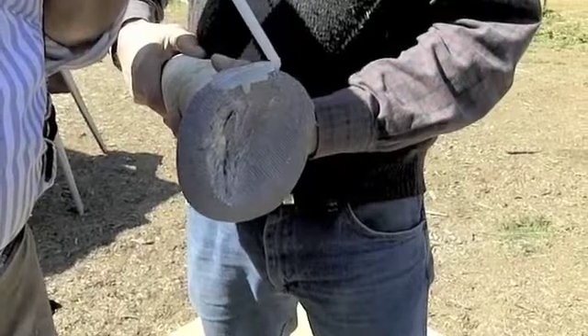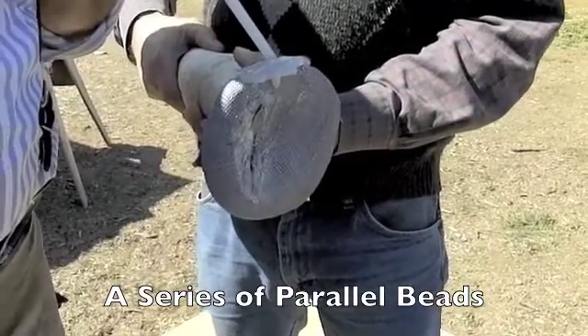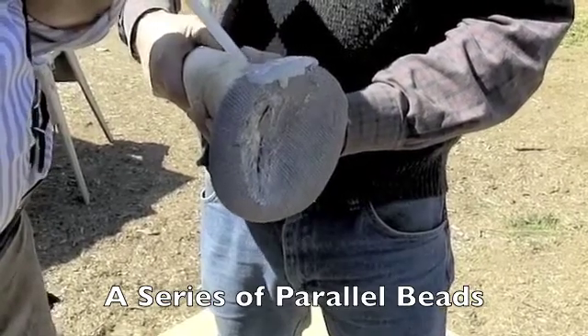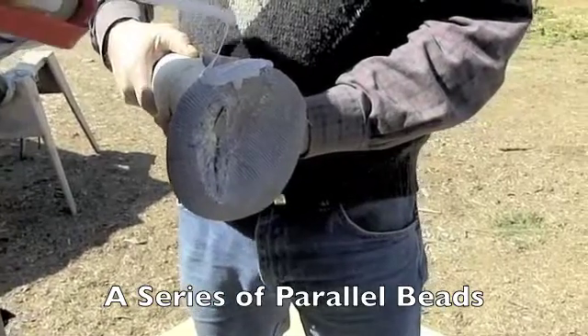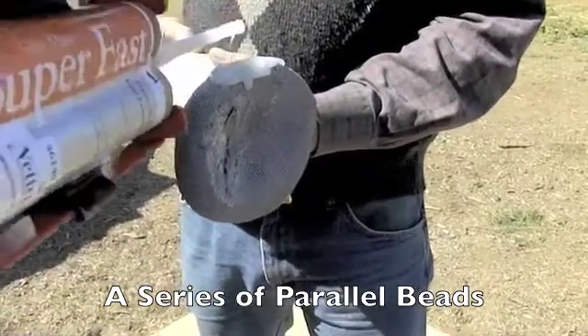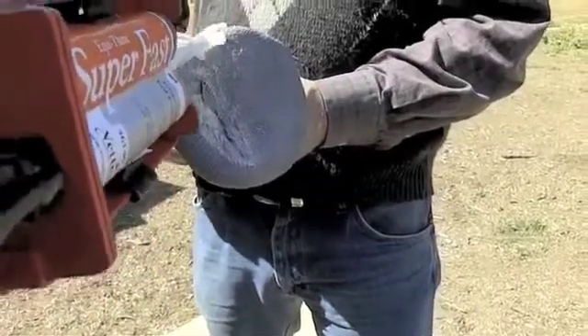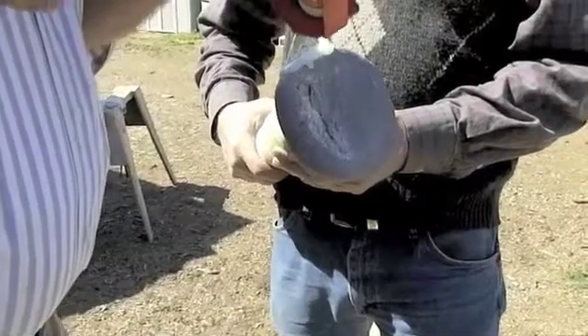This will change the biomechanics of the hoof — we're going to bring the foot back into the center of the bony column. Then swing it around so you've got the bottom of the foot and make sure there's enough support on the bottom of the foot as well.